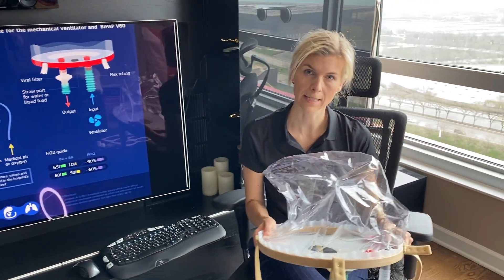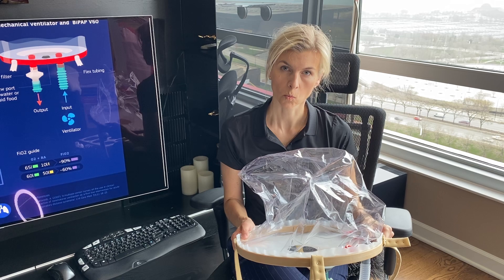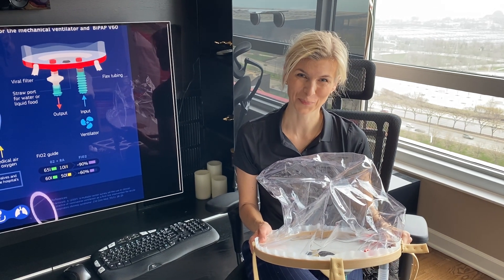You can see more on our infographics how to connect all these pieces together. All these guidelines are on our website from University of Chicago. Thank you.